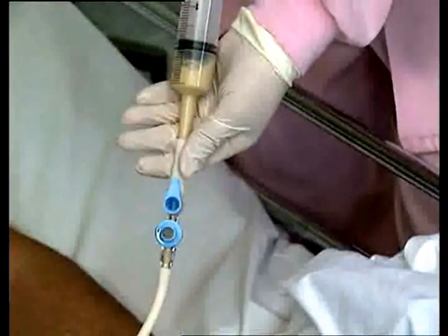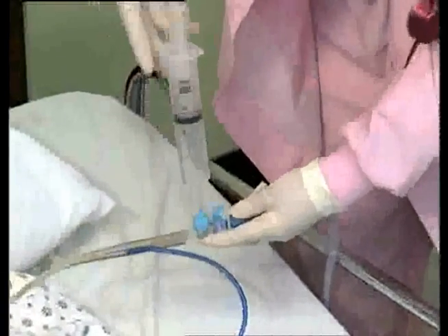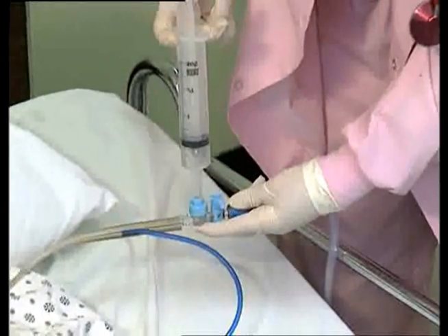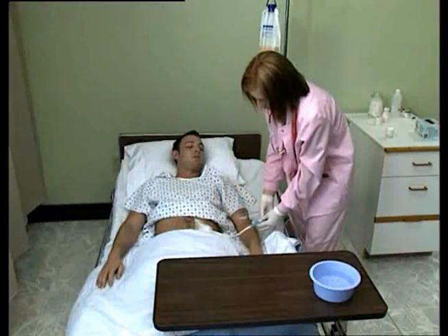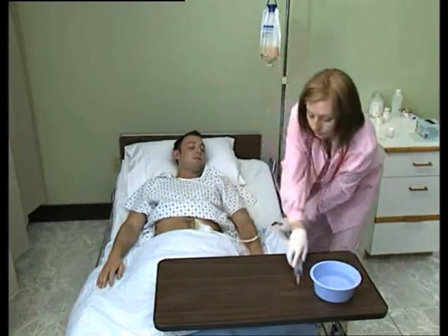The ACE Connector provides in-line feeding, suction, irrigation, and medication delivery without ever having to disconnect the patient. Dale's ACE Connector is a cost-effective, easy-to-use system that protects clinicians from infectious splashback, while it shields your patients from external contamination.